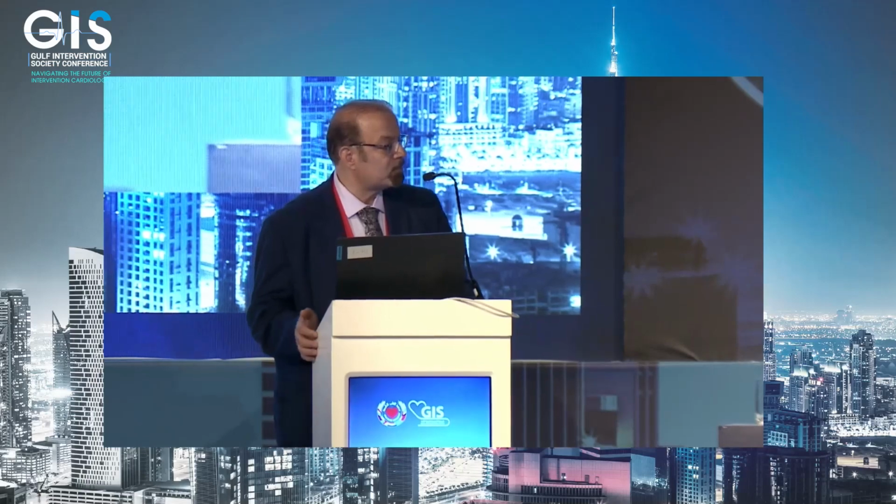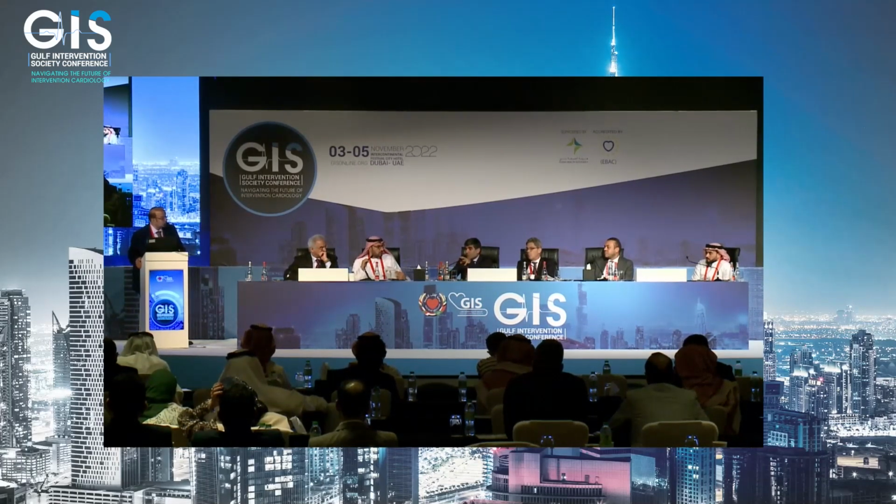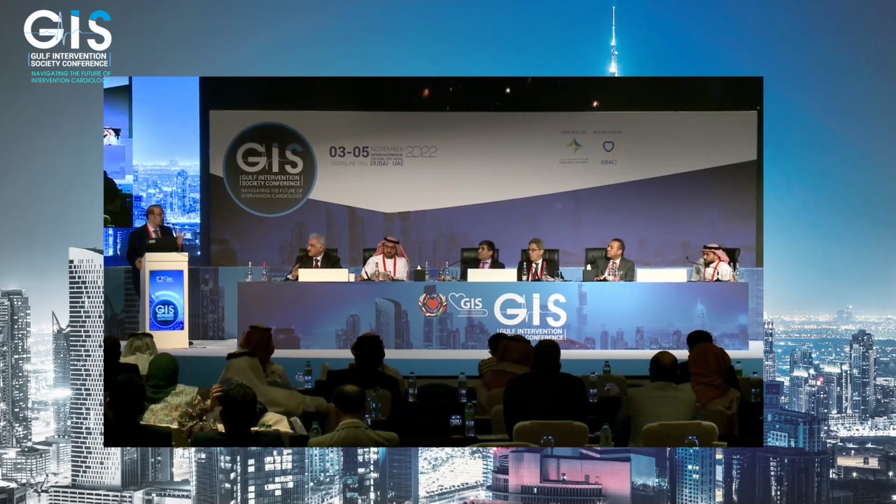Just a quick note, that's to a certain degree not correct. You could still go behind the struts, particularly with hydrophilic wires, so you just have to be careful. To be honest, when they first presented, my thoughts were exactly the same: have you gone behind the struts and then inflated, causing that little deformation of the stent? But stent fracture has to be considered, particularly when we have a long stent on a hinge point, and particularly with cardiac contraction. Down the road, they might fracture, and this is more likely with stents with smaller connectors, like 2 or 3 connectors. But this patient had thrombosis in the lumen, and we did not face any difficulty crossing with the wire or the balloon at all.